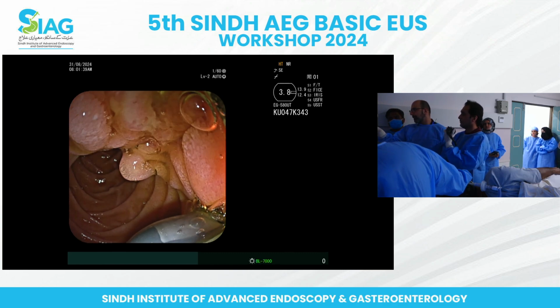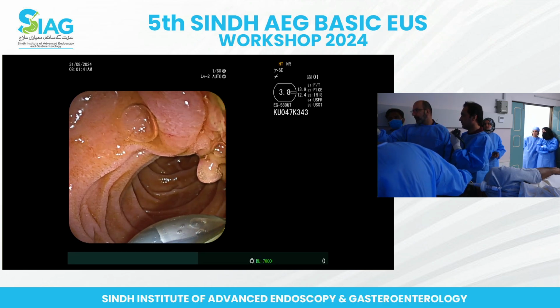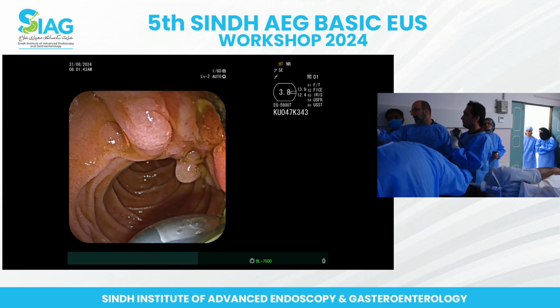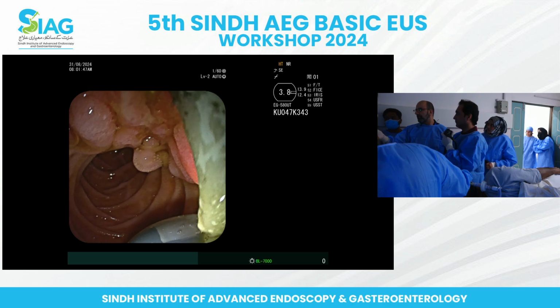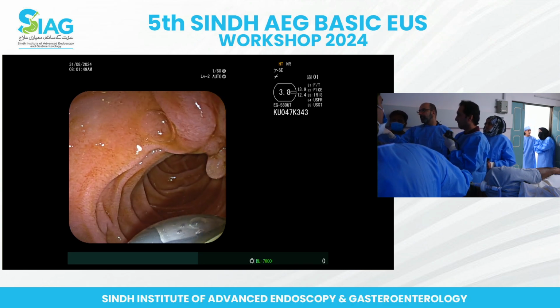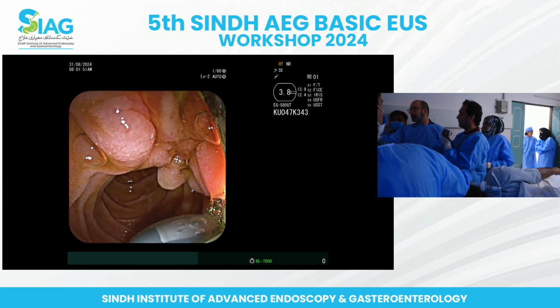So keep pulling back, and you'll start seeing the stent in a minute. So that's the area of the papilla. Keep pulling back a bit. There's the stent, and nothing really, but I can't tell with this view if it's ulcerated or not, because it's also had a sphincterotomy, but there's some fullness here.